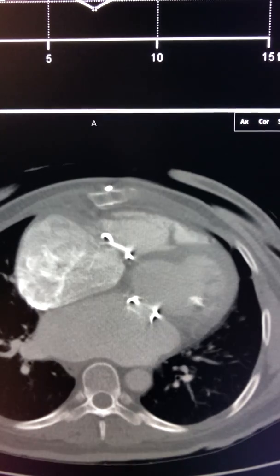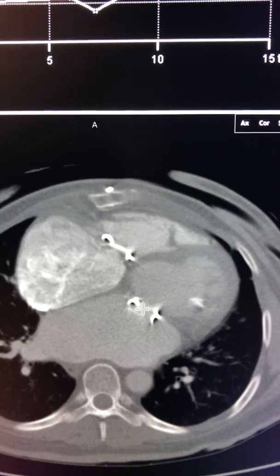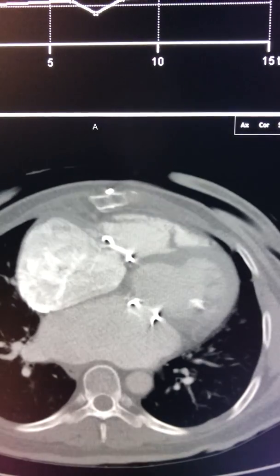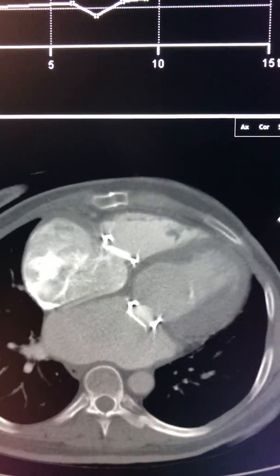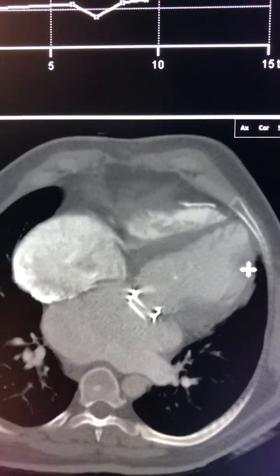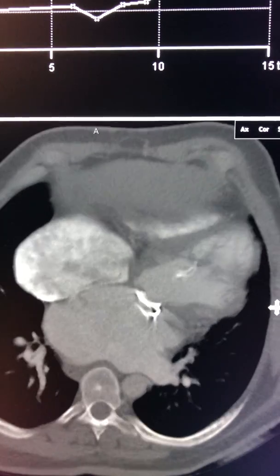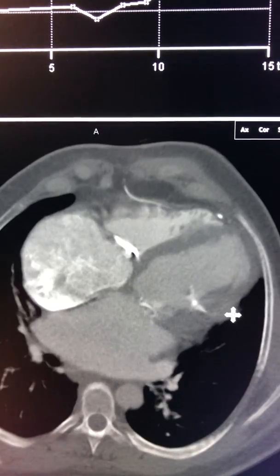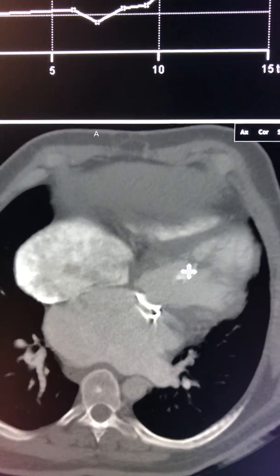Looking very closely at the chamber and further assessing the chamber morphology, these appear to arise from the papillary muscles.